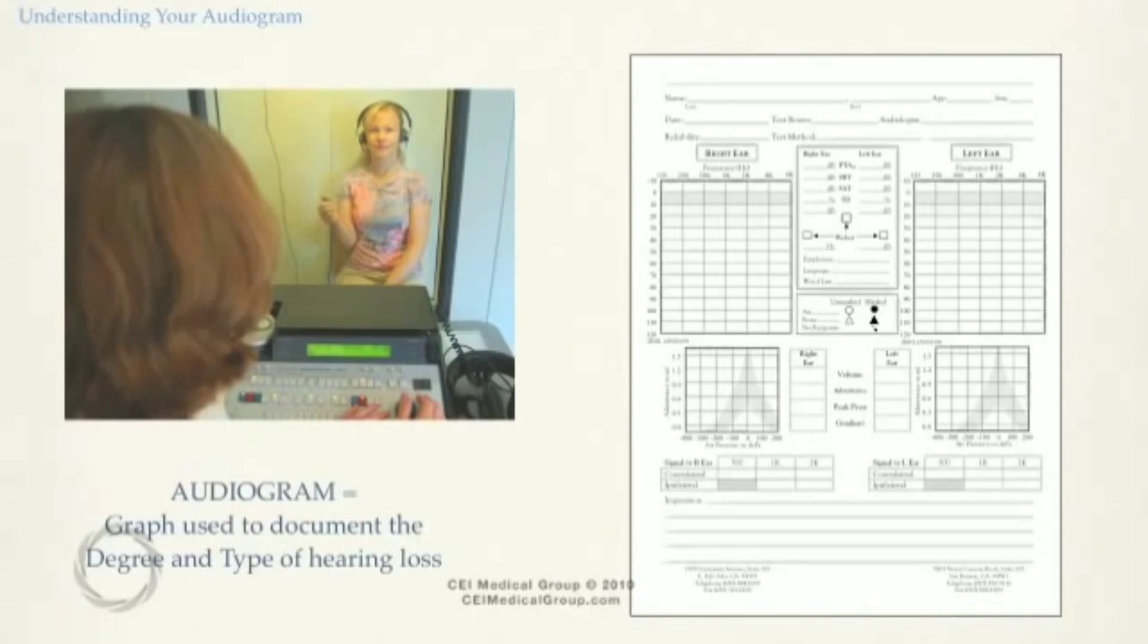As you can see from this form here at CEI, there are other tests your audiologist may complete for a well-rounded approach to your hearing health care. However, for now, we'll just focus on the audiogram. Let's look closer.